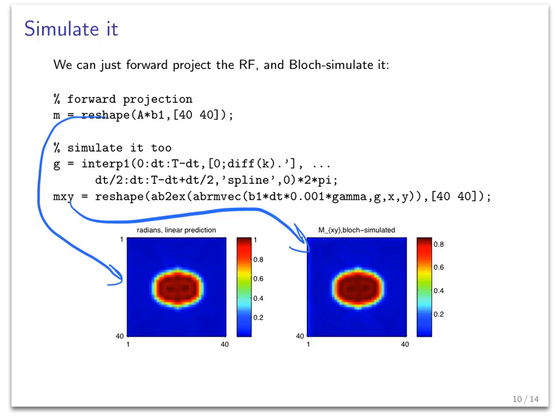This is a small tip angle pulse. It's a relatively small tip angle pulse, and so we expect that the patterns we get are going to agree whether they're cast in terms of flip angle or in terms of Mxy. It doesn't matter which units they're in.